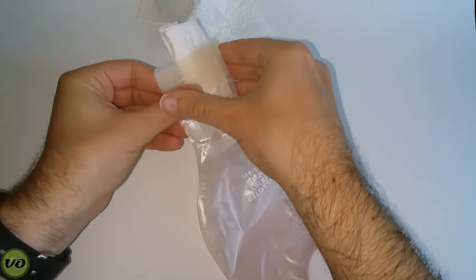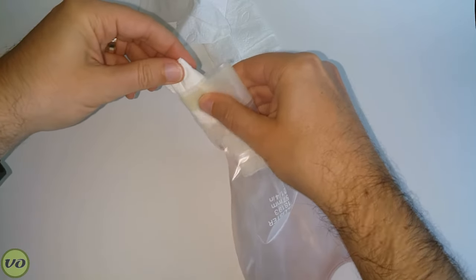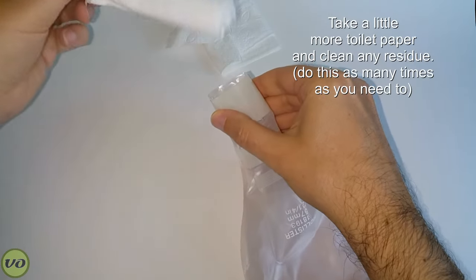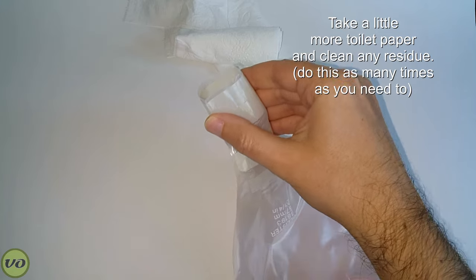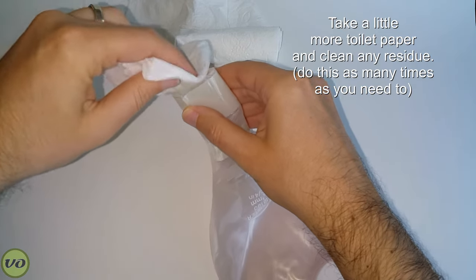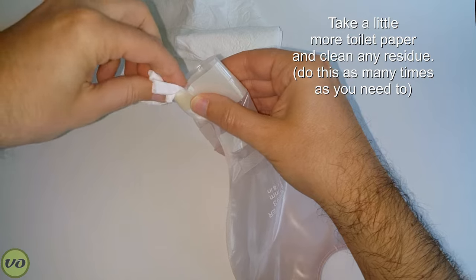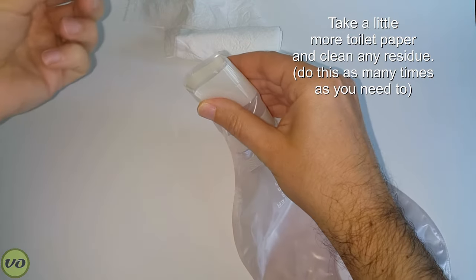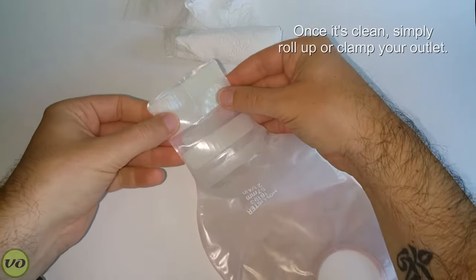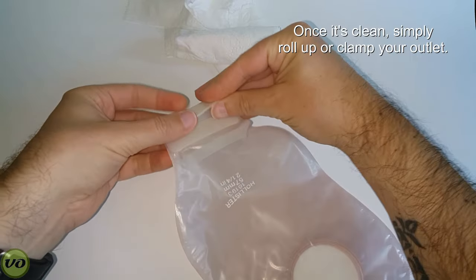So I just basically roll that around, I try to get as much as I can out of there, and usually one time is enough. Sometimes I may do it more than once, but I'll get another piece of toilet paper and I'll just pick up any of the residue that I might have left. And that's basically it, there's really nothing else left to do to clean it.